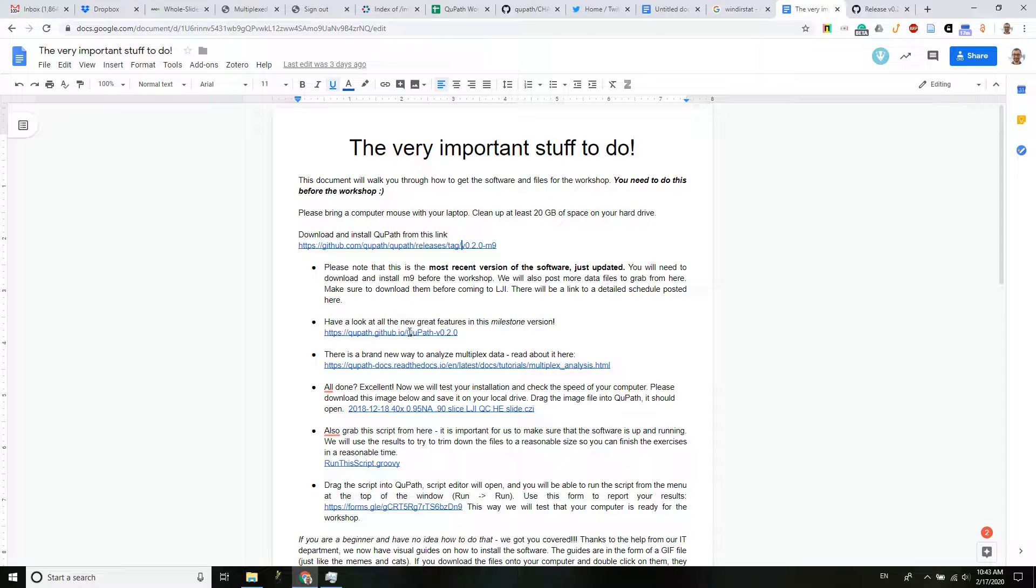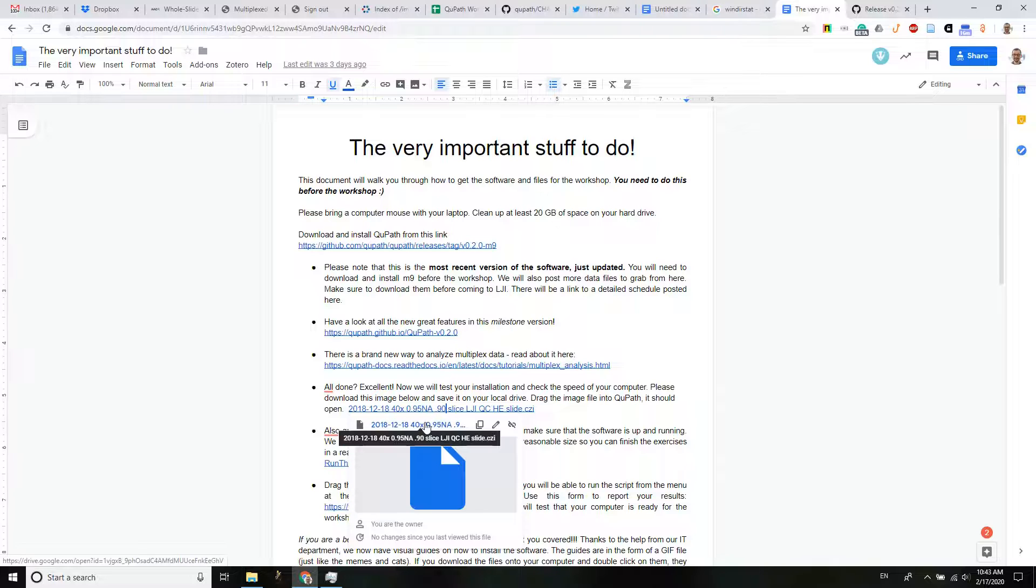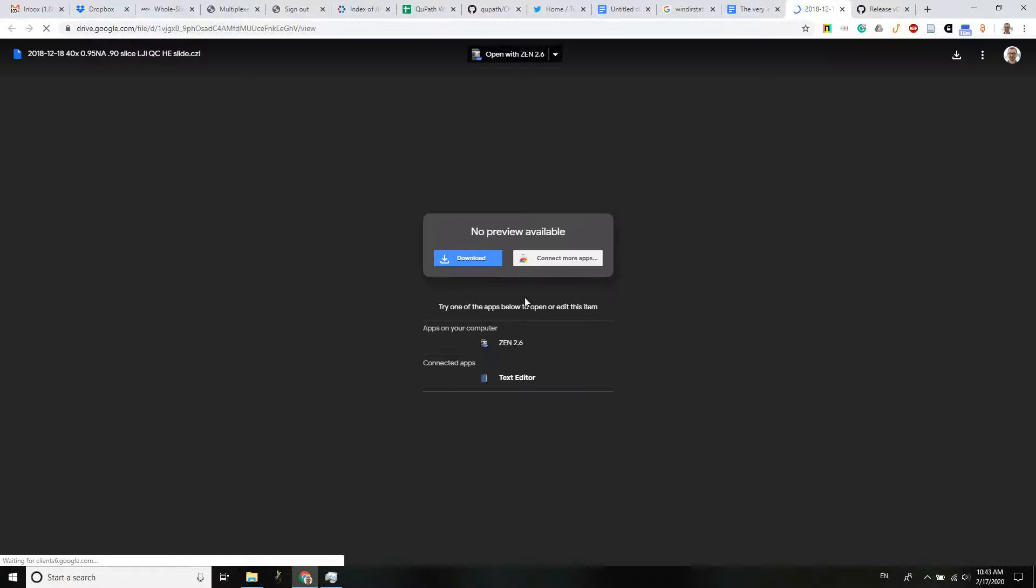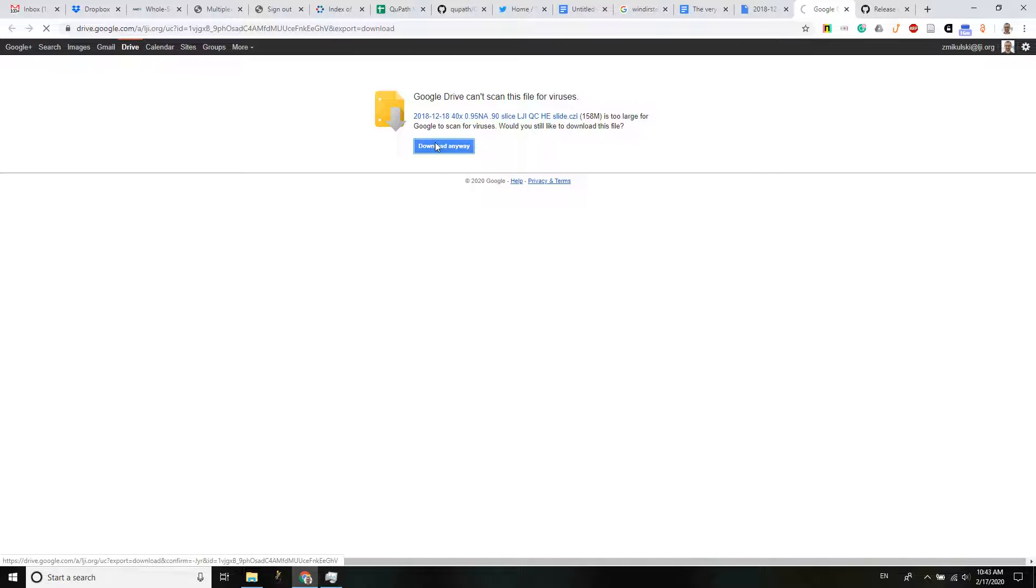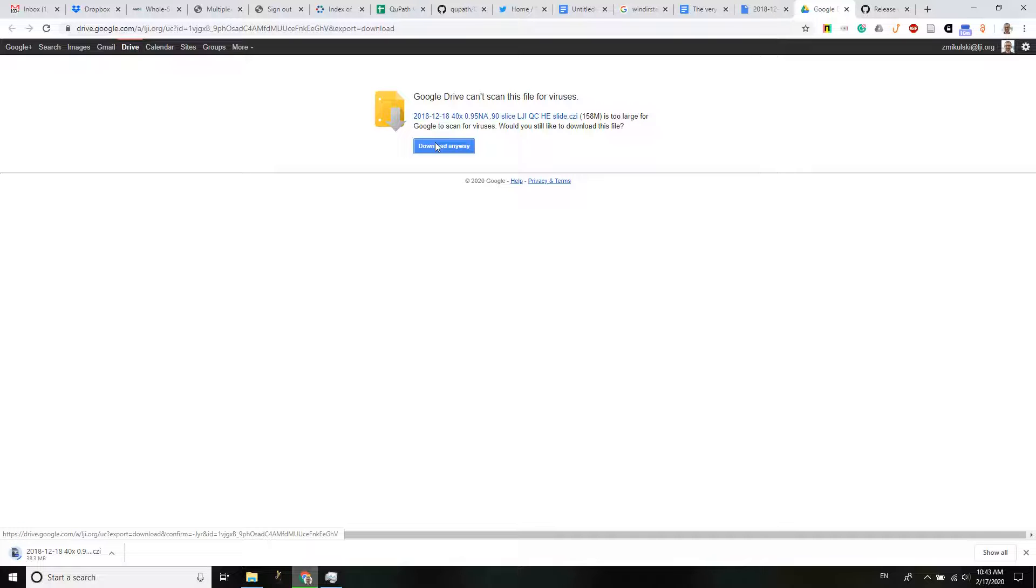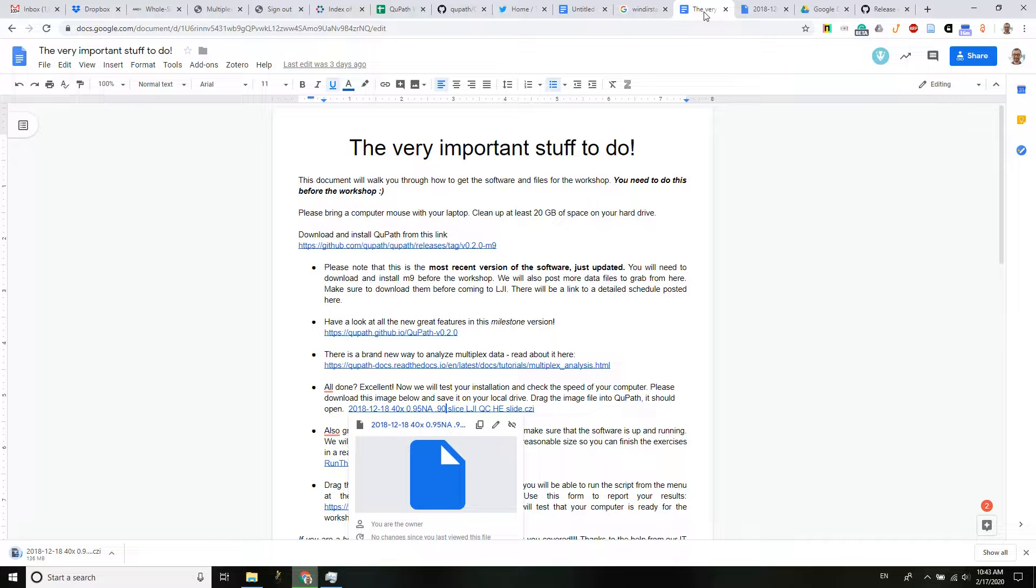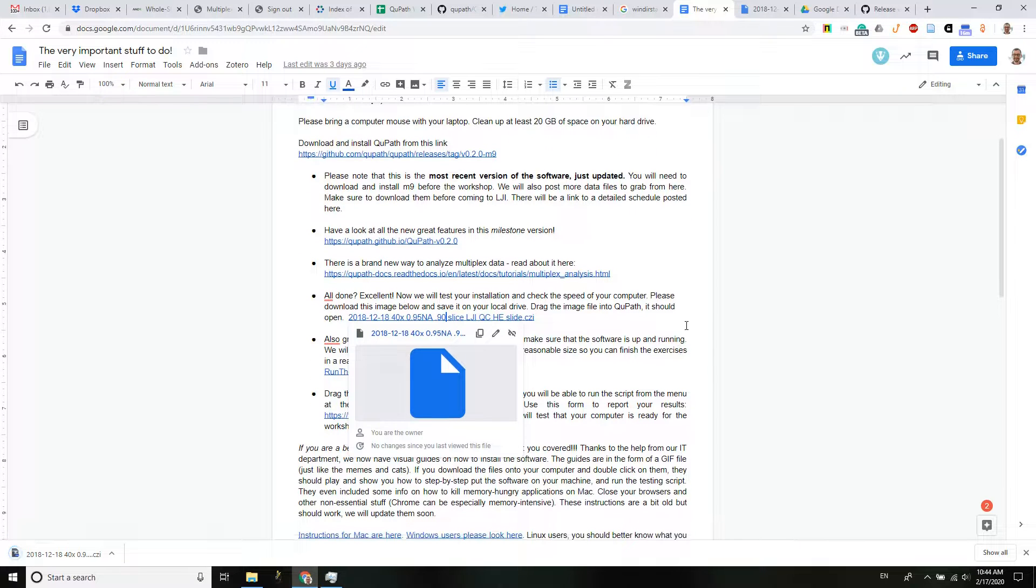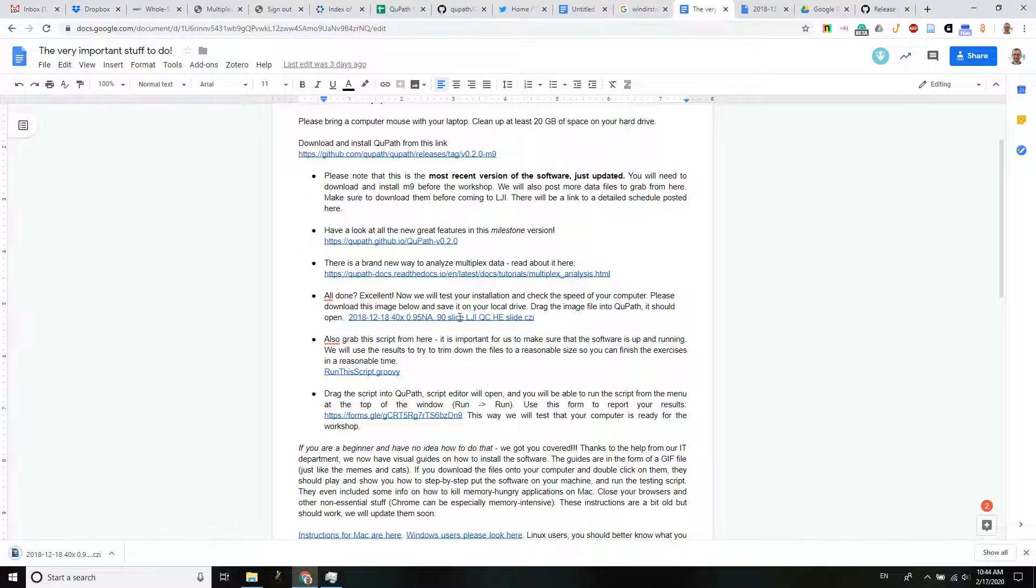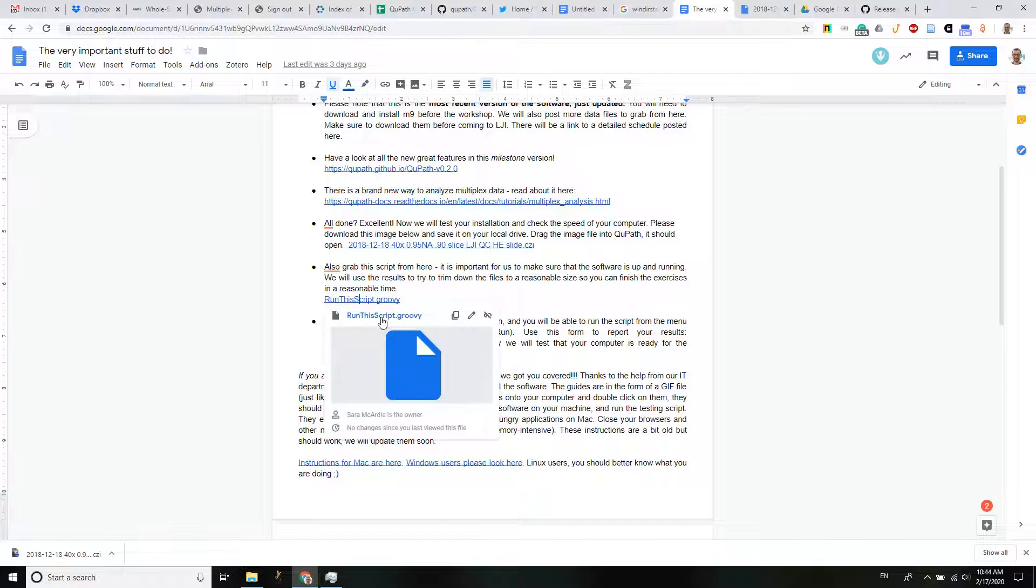Okay, so the next thing would be to look at the features and discover new ways how to analyze multiplex data. I will download this file and I will show you how to run through the script that will test if the installation on my computer was successful.